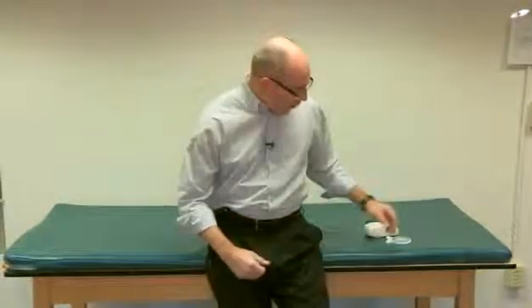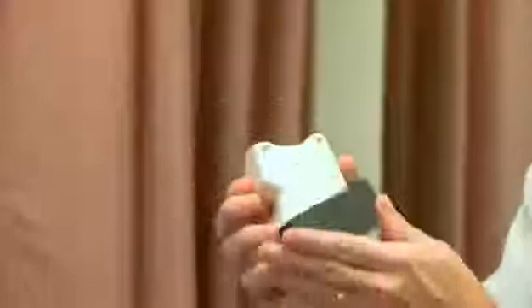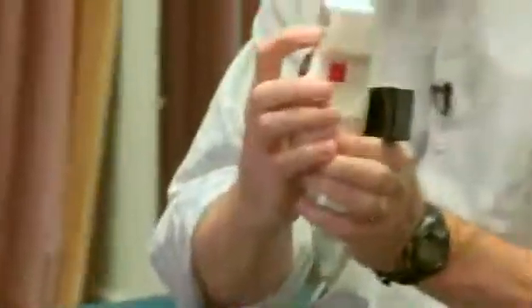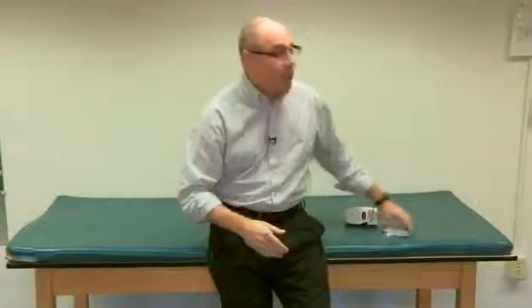So what we've gone over today are measurements that can be obtained with this digital inclinometer. As indicated, it's one of three different models made by Hogan Health Industries. This one, the MicroFET III, has the further advantage of being able to be used as a handheld dynamometer. There's a plate against which the person being tested can apply force. By pressing the muscle testing button, you get a measurement — in this case 47 pounds. It's also worth noting that compared to a traditional analog inclinometer, the digital device allows you to set a measurement and then automatically calculate the excursion.